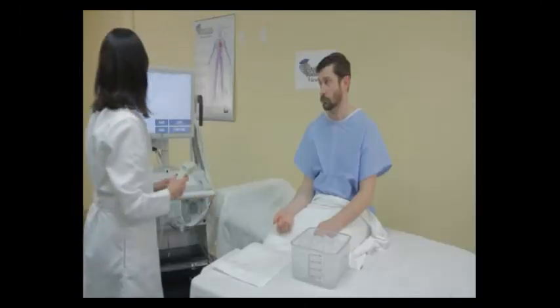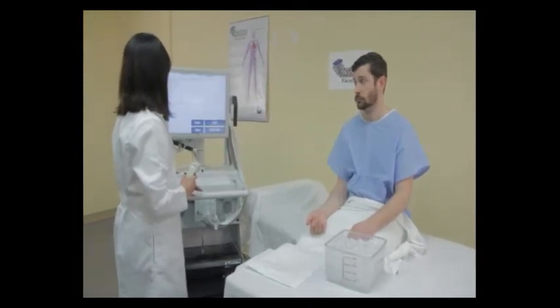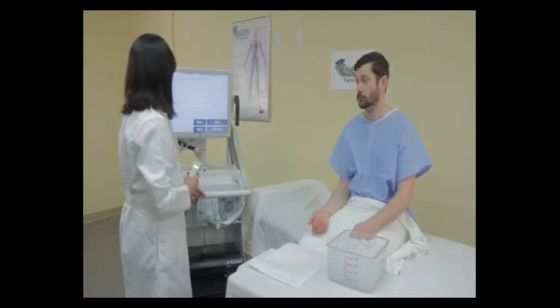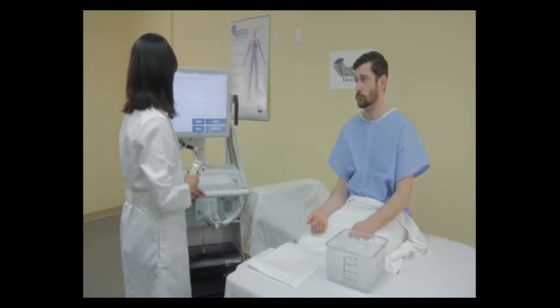What we're looking for is how long it takes the patient to recover to pre-immersion temperatures. In patients that have a normally operating system, there will be a compensatory effect after the hand is removed from the ice water bath. A signal will be sent to vasodilate the arteries to flow warmth back into the hand, and frequently you'll see temperatures above baseline in as little as five or ten minutes. That would be considered a normal study.